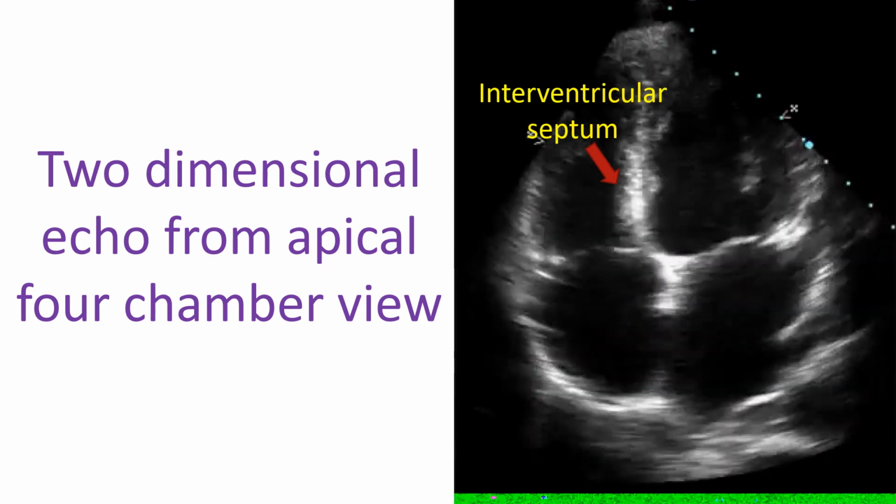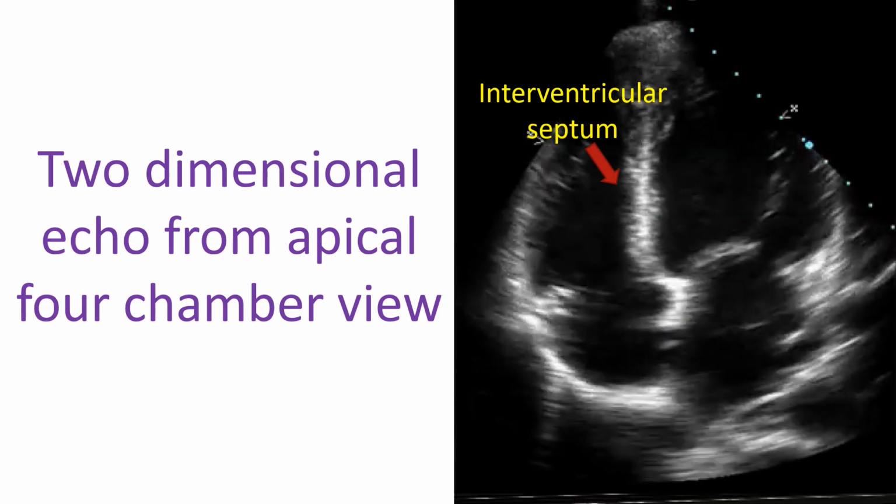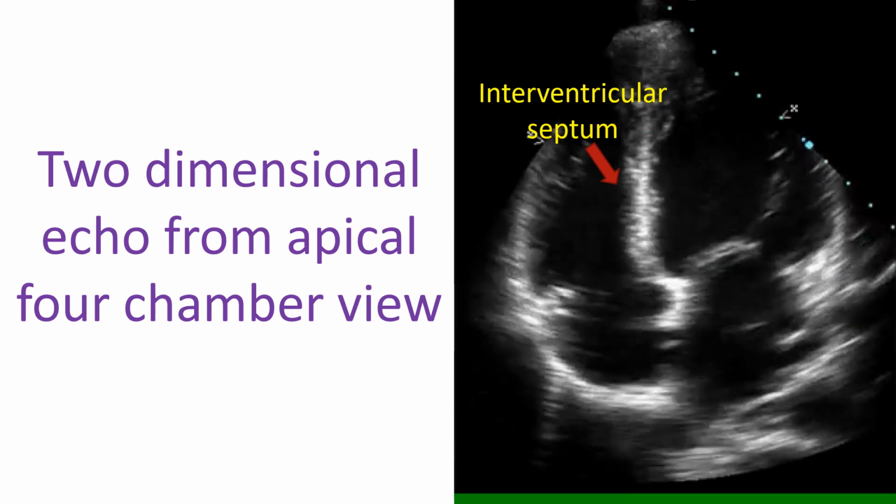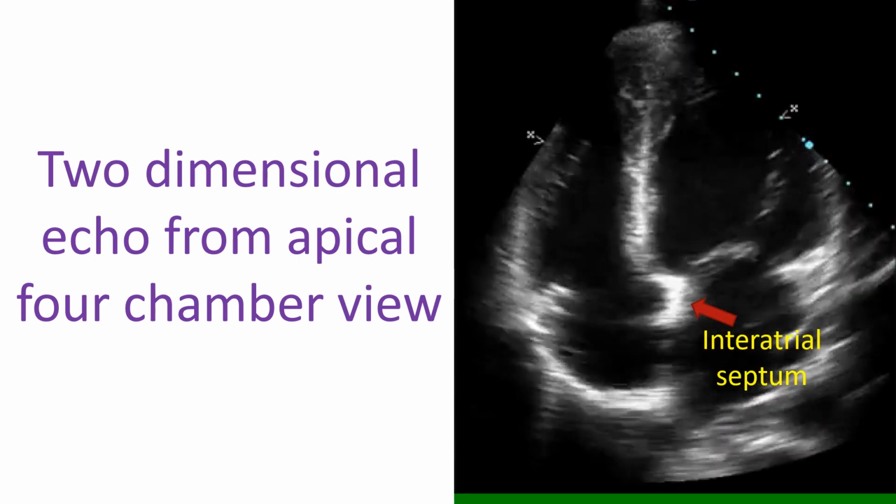The interventricular septum has been marked in this view. Here the interatrial septum has been marked.